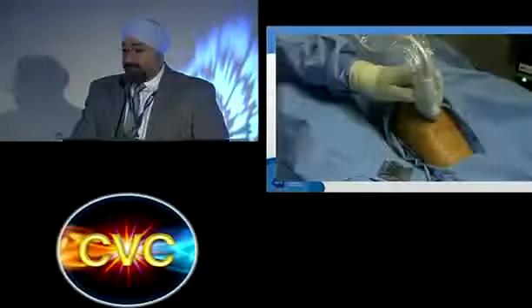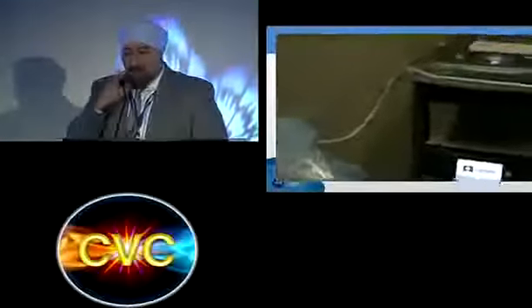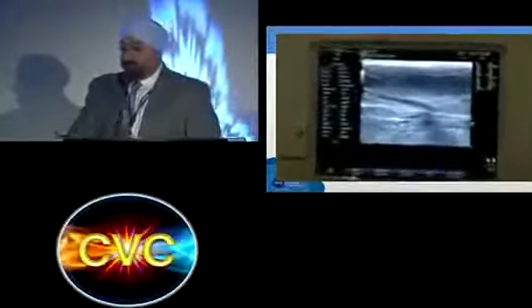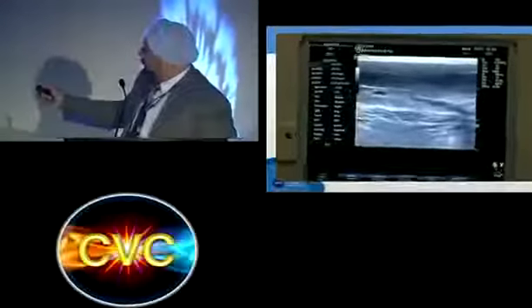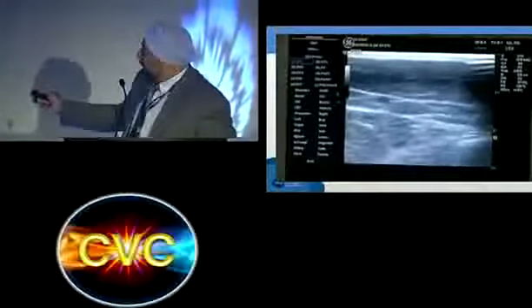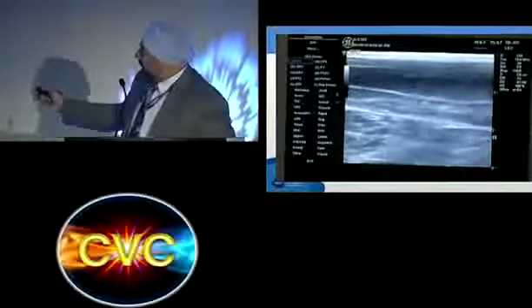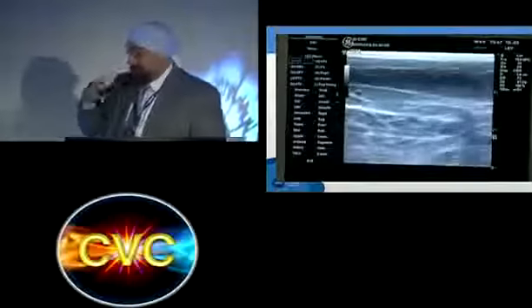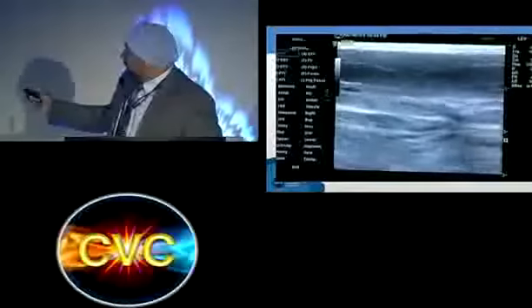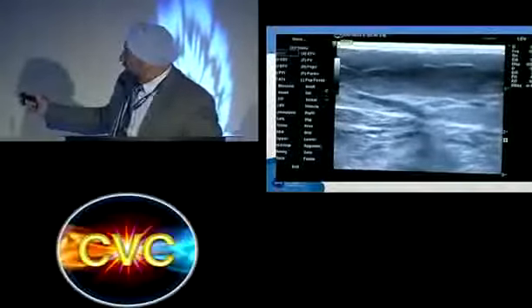So I'm doing the ultrasound now, and you can see on the screen in a moment where I find the perforator, and that's leaking into the large branch, and that branch obviously goes up and is feeding into a whole bunch of other veins, varicosities and reticular veins. So I'm going to come back and then take care of that perforator. It's very important to identify where the fascia is and where exactly that perforator is feeding in.